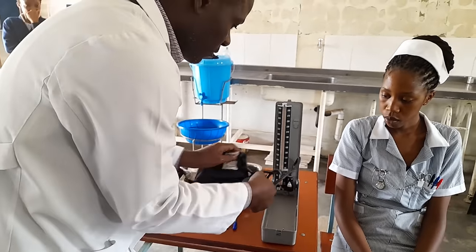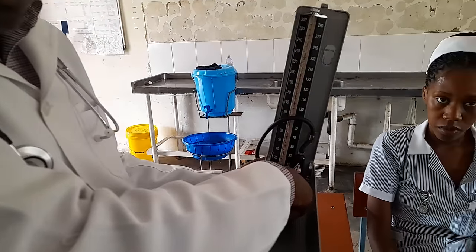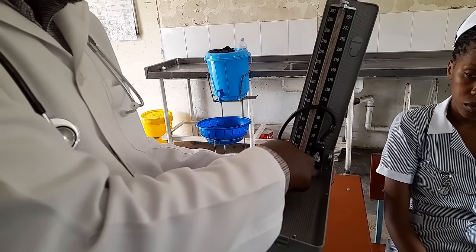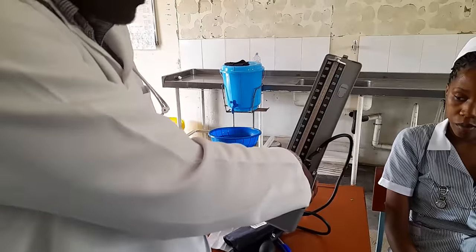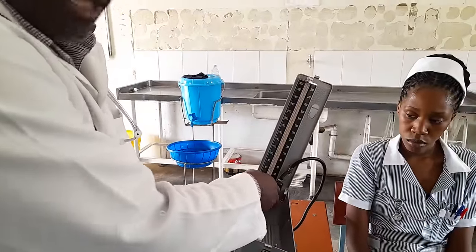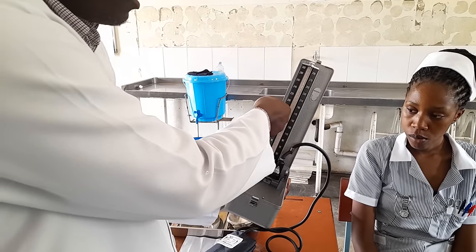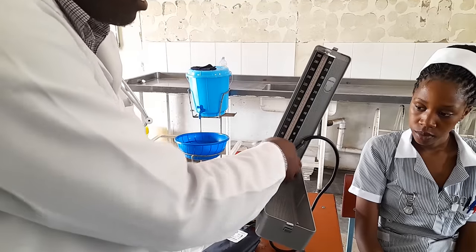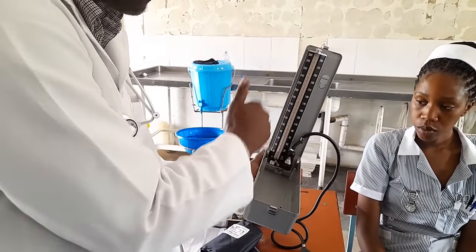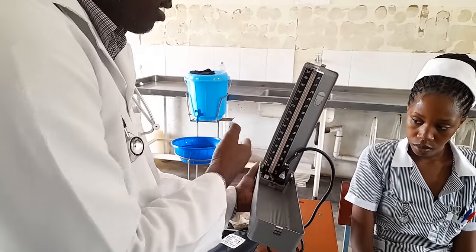There's another button here which is for off and on. Some machines have a label showing which side is off and which is on. When it's off, the mercury will not rise in the graduations. You have to press it to the on position so that as you pump, you'll see the mercury rising. When you find it off, turn it on like that. Some machines don't have this indicator, but you have to know that when it's in one position it's off, and turning it the other way means the mercury will rise.